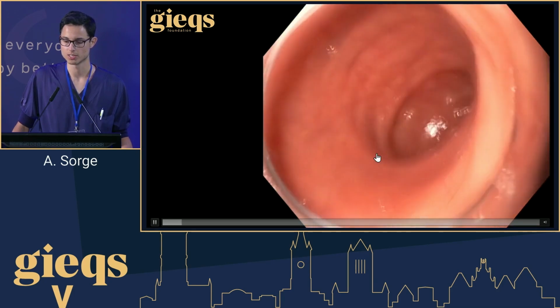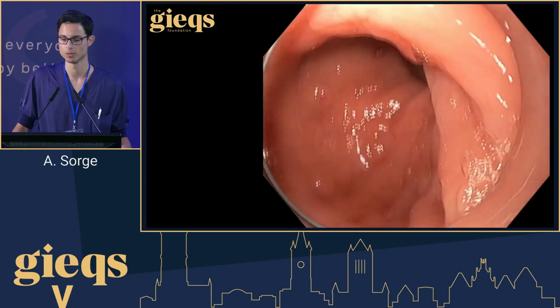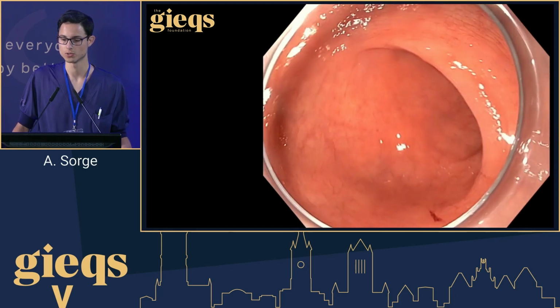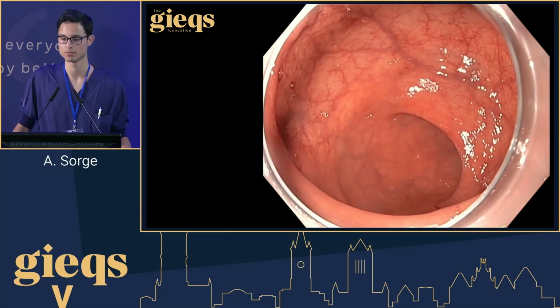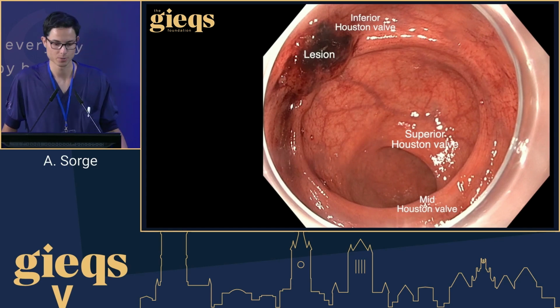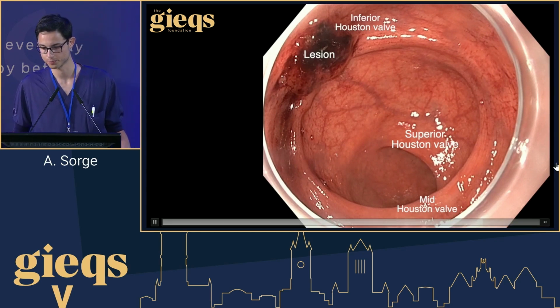This video shows another lesion. This is a pull back in forward view. We will see a lesion in a while. So superior Houston valve with maximal insufflation, mid-Houston valve, inferior, and that's the lesion. It was previously biopsied, so it is bleeding, but that's just to show how to localize the lesion.